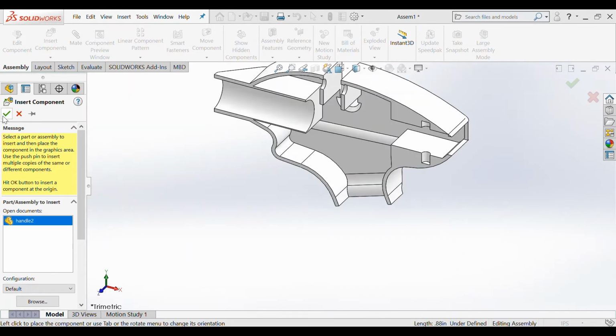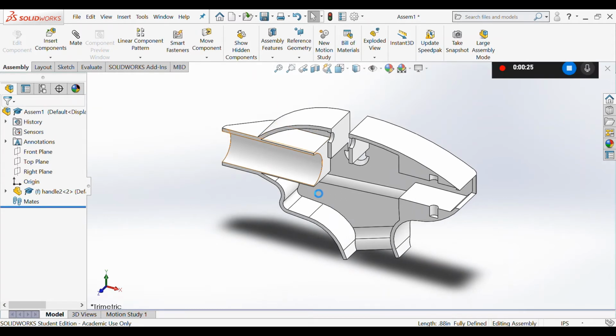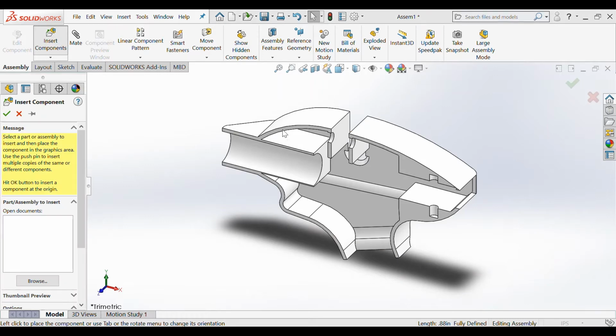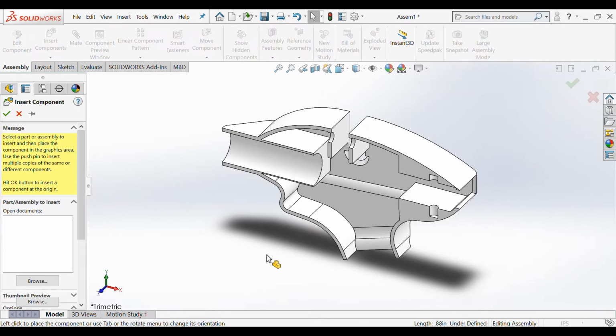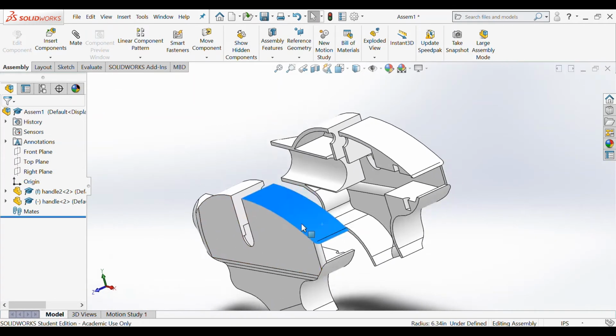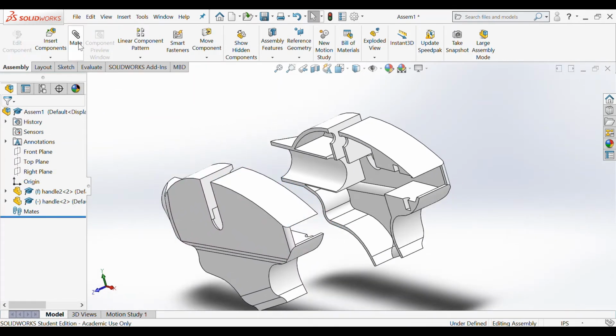So we're going to click this green check mark, and it's going to fix this part to the origin, as you can see by this little F right here. Now we're going to insert the other half of the handle. Go ahead and click to place it. We can drag it around a little bit.